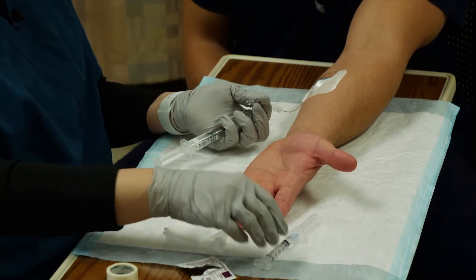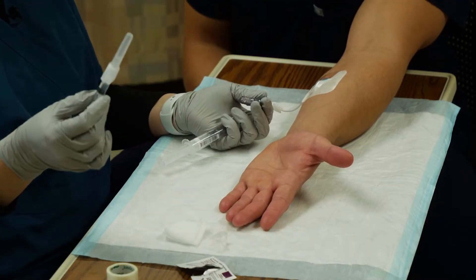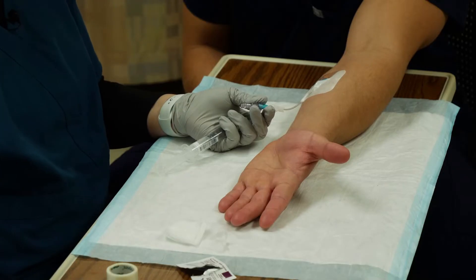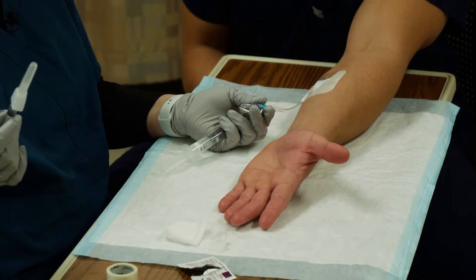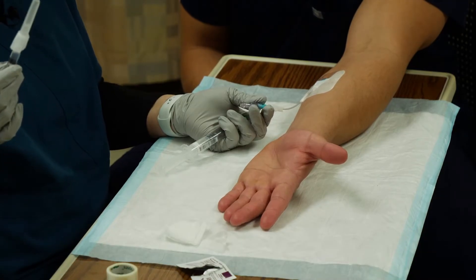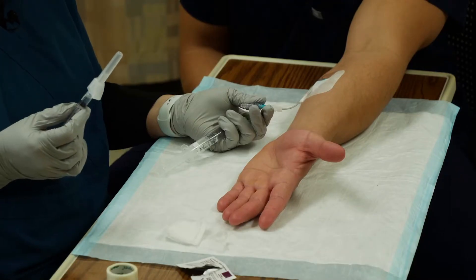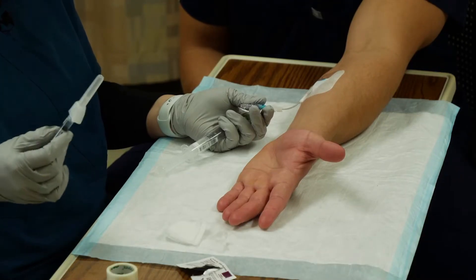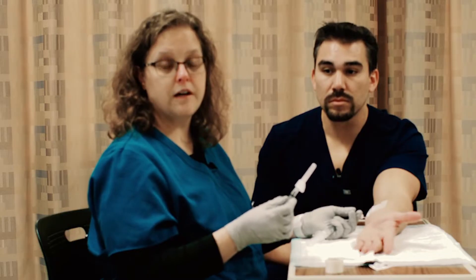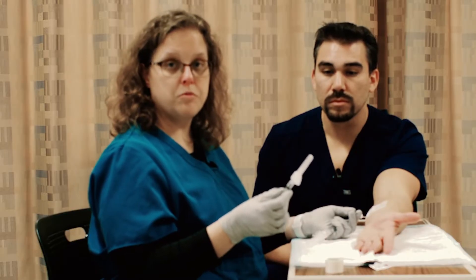Now I'm going to use the rest of this in a minute. This is going to be my IV push medication. Most medications have a certain amount of time that you should push them over. One milligram of morphine and ten milligrams of morphine are both available in one milliliter of volume — it doesn't make good sense to push those at the exact same rate. You can get four milligrams of decadron in one milliliter, or ten milligrams in one milliliter. If you push those at the same rate your patient's going to be very uncomfortable. You need to know your drug and how fast you can actually push it.